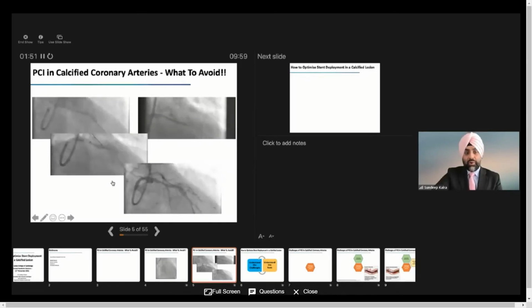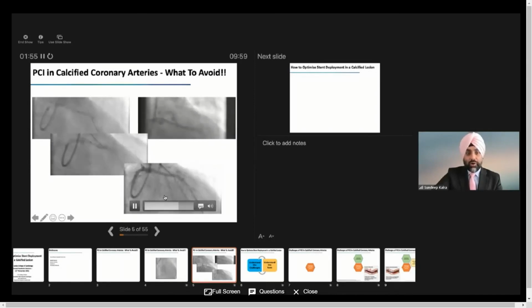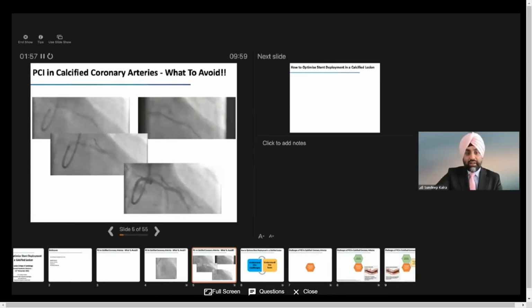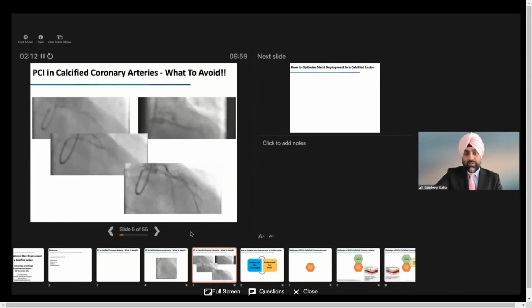In the third panel, we can see when the second stent is deployed, there is dog boning of the stent. It's incompletely expanded. That's a non-compliant balloon, and they're trying to post-dilate it. We can see the final result is, despite high-pressure non-compliant balloon inflation, there's incomplete expansion of the proximal stent. And this is how the case was left. This was not treated any further.